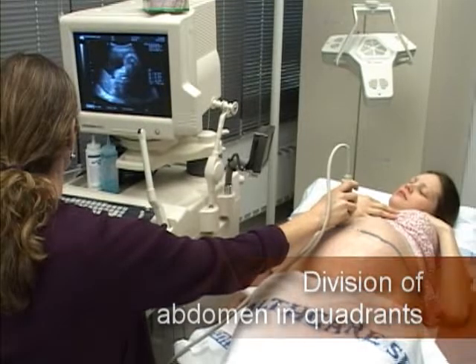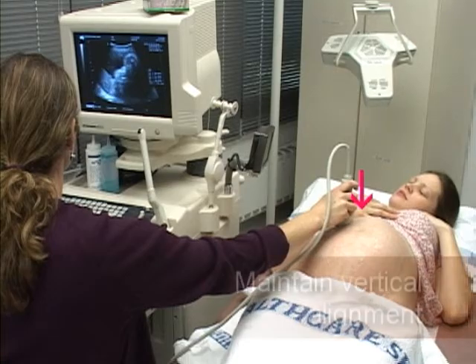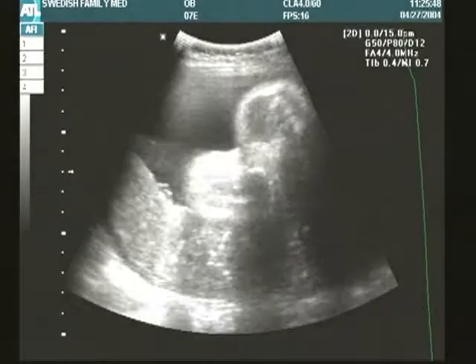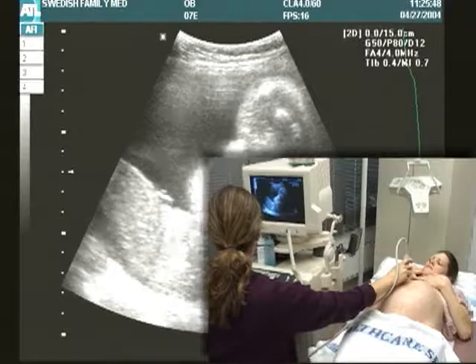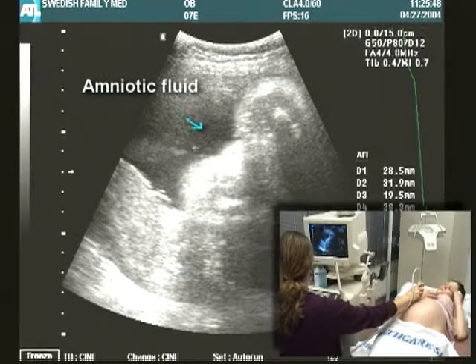Measure the amniotic fluid index by first dividing the maternal abdomen into four quadrants at her umbilicus. Keep your transducer in the vertical position along the sagittal plane at all times when measuring each of the four quadrants. Begin with the right upper quadrant, identify the deepest vertical pocket of fluid, and freeze this image to take the first measurement.